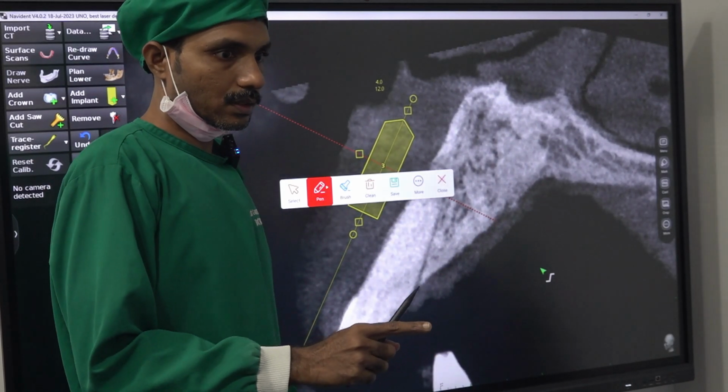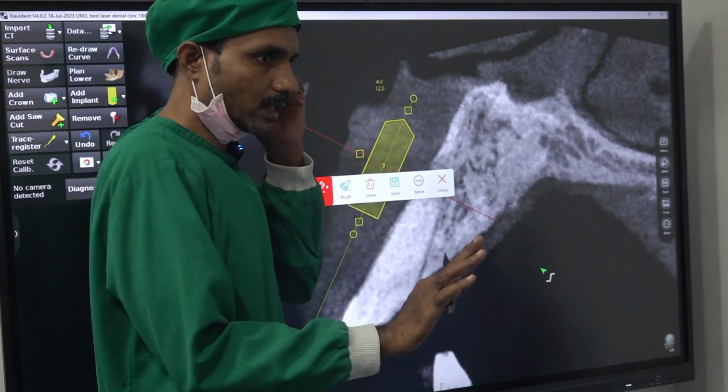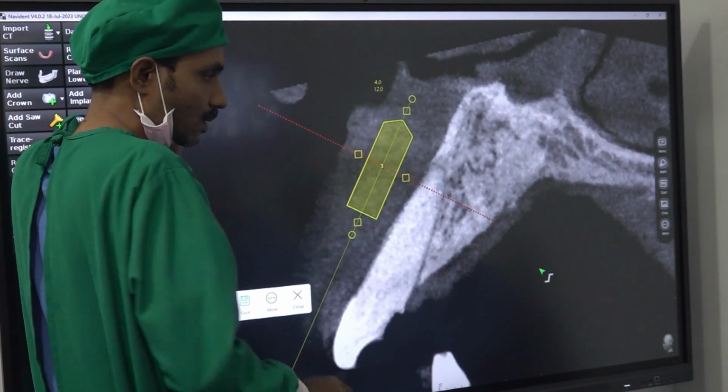Welding you want to see or? Double welding. No, single welding. Welding same, like yesterday. Yes, okay. Now start, Maran.